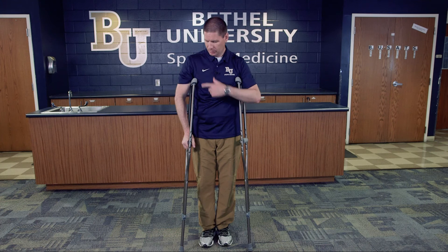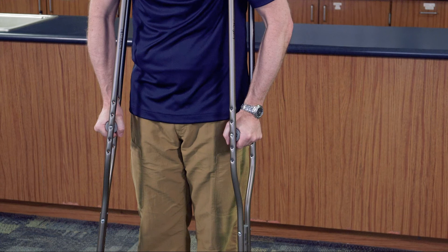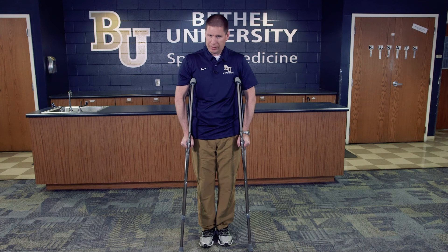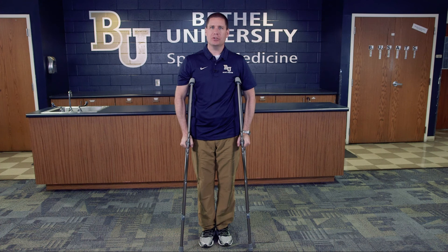The other thing to measure is the arm handle height — you want just a slight bend in the elbow. You don't want it at 90 degrees and you don't want it fully extended, just a slight bend like this. If the athlete is sagging down, tell them to stand straight up. Once this is all set, they should be fully fit and ready to be instructed on how to actually use the crutches.